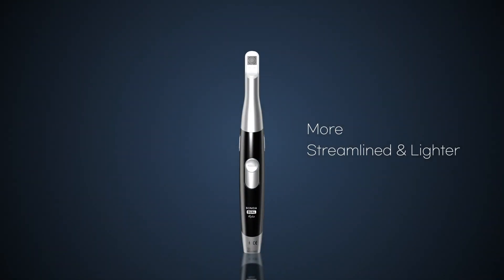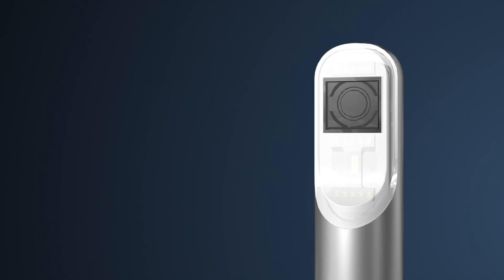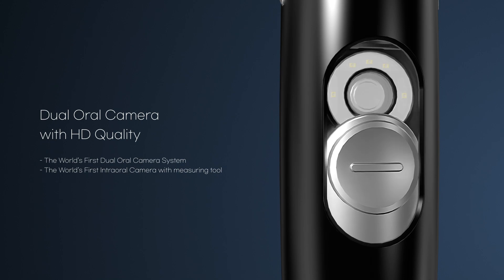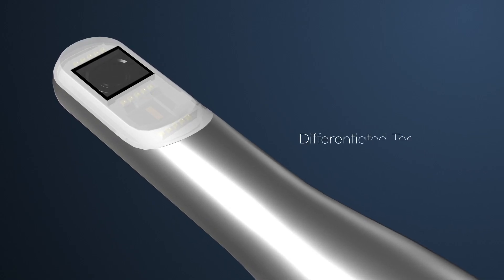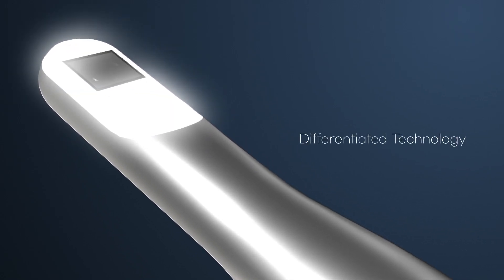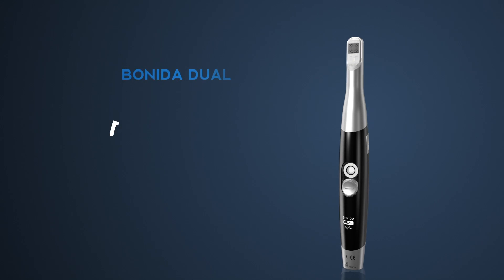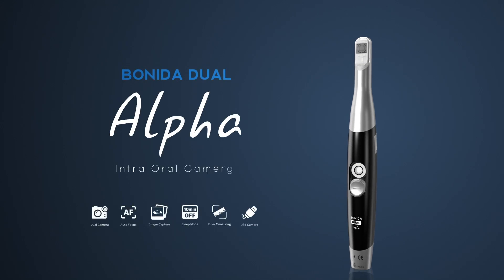A more streamlined and lighter dual oral camera with HD quality — differentiated technology, innovative in oral cameras. Introducing the Bonida Dual Alpha intraoral camera.